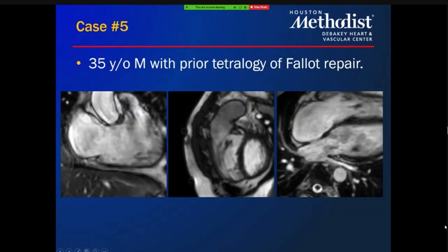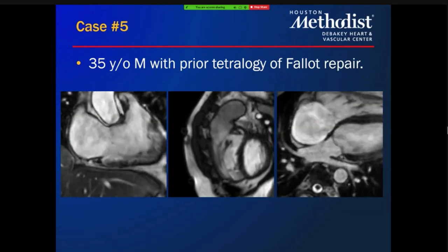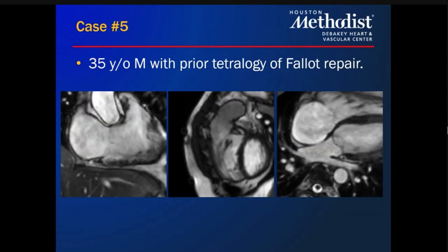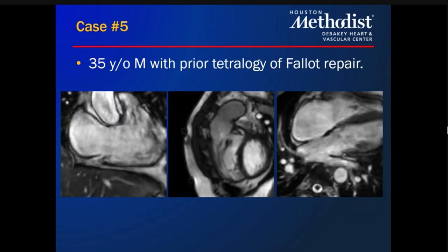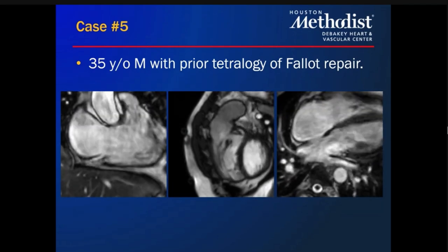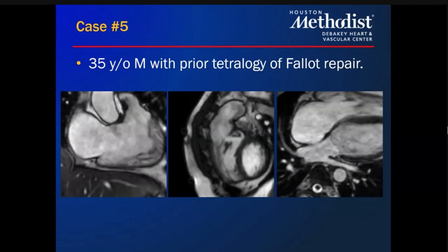Now, for this method, because the pulmonic artery is pretty fixed and doesn't move around much, we can actually do direct pulmonic regurgitation methods with a little more confidence, just like we do with AI to estimate PR. Although I still insist on the techs doing IVC and SVC inflows, because sometimes the turbulence in the forward flow of the pulmonic artery makes it harder to quantify the forward flow accurately as well.